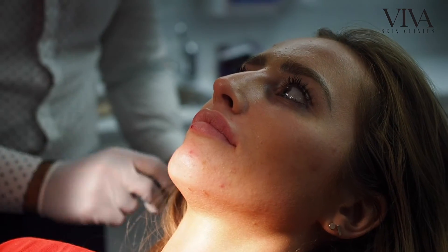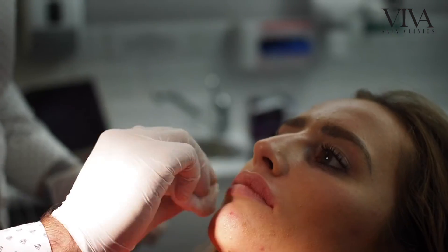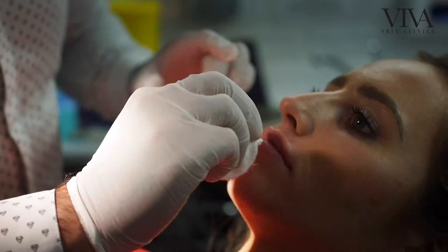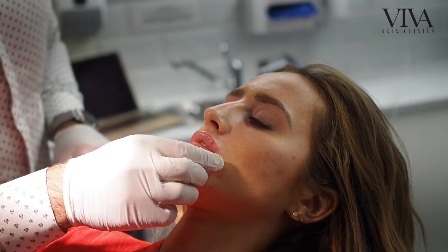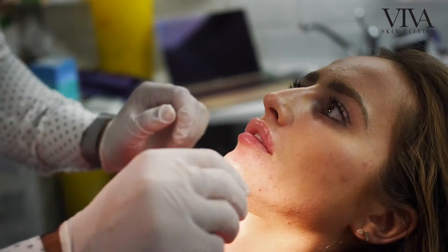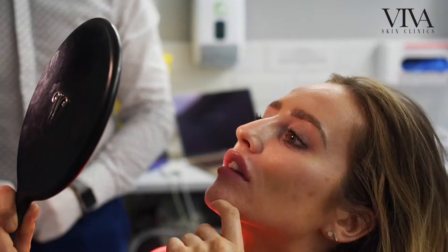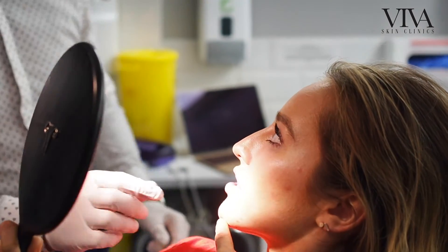Arnica is a really nice anti-inflammatory gel — quite a natural based anti-inflammatory gel — and it just helps to sort of soften and reduce the inflammation. Lips together. Have a little peek. Oh, they look good. Yeah, that's really, really natural, like just a really natural enhancement here and here.